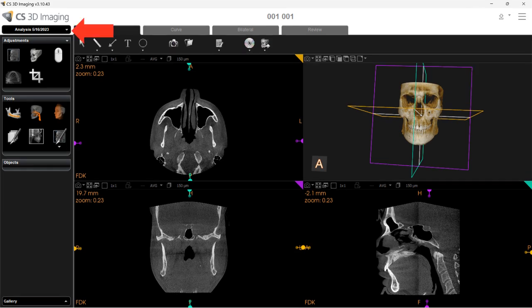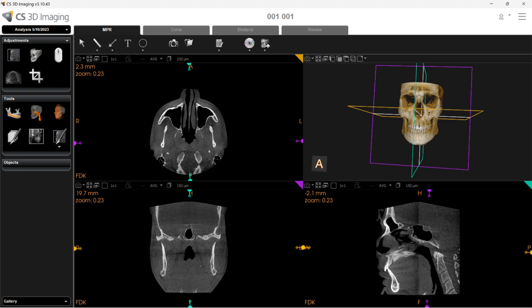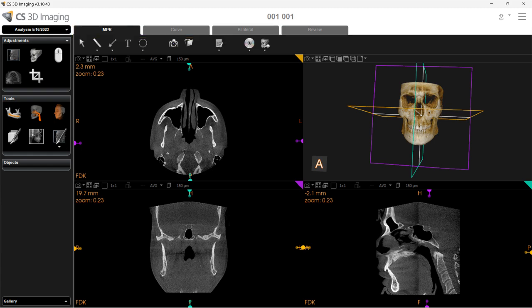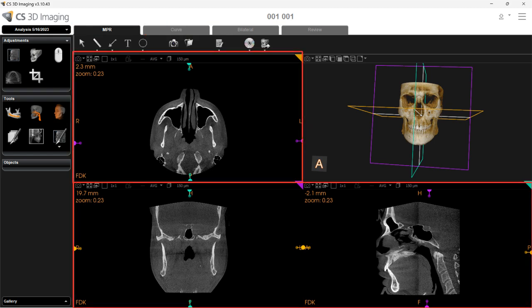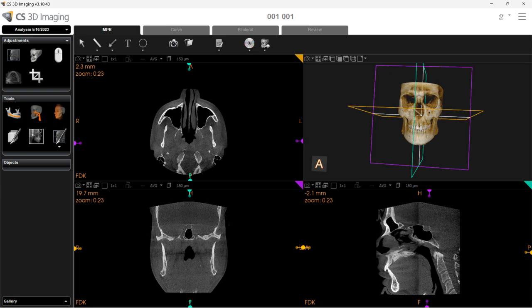The Analysis Management drop-down enables you to create or edit distinct treatment plannings for the same volume. Next are the workspace tabs. Each workspace tab contains multiple view screens based on the tab you have selected. For example, on the Multiplanar Reconstruction, or MPR tab, you can view three 2D MPR view screens and one 3D view screen. Below the workspace tabs is the horizontal toolbar, which is used to create annotations, shapes, screenshots, reports, and export functions.